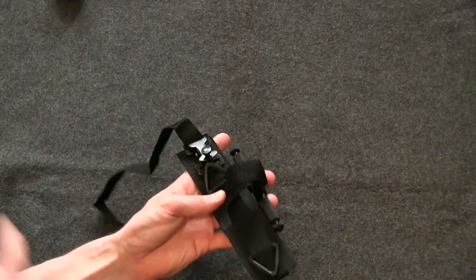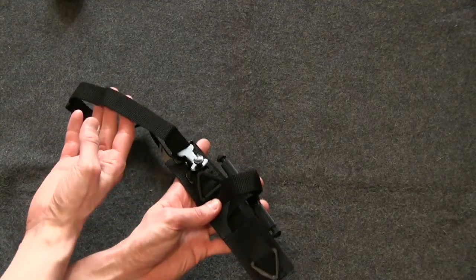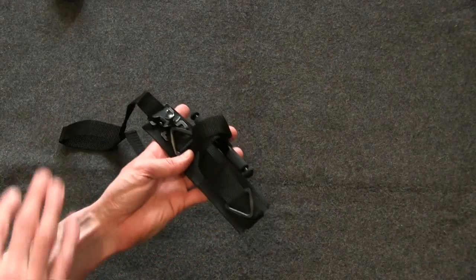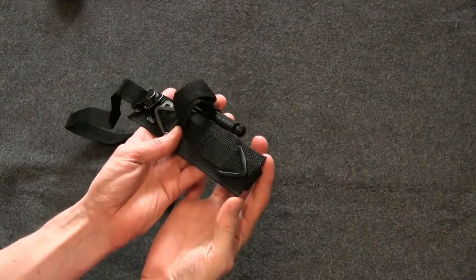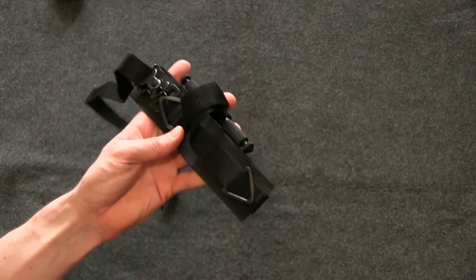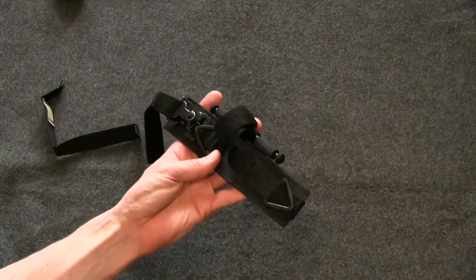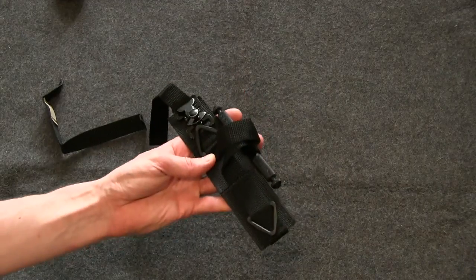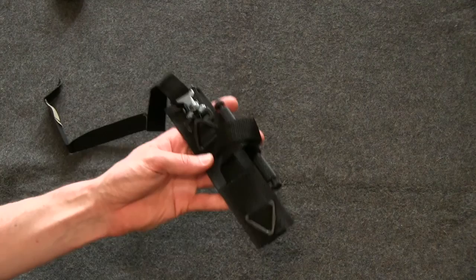Now some people might be wondering why the strap is so narrow. I believe there is also a version available where the strap is a little bit wider. If I remember correctly, the CAT is as wide as this section all the way through, but I took the narrow one because I would say that it might be a little bit more effective. I have absolutely no scientific proof that it is so, but anyhow.